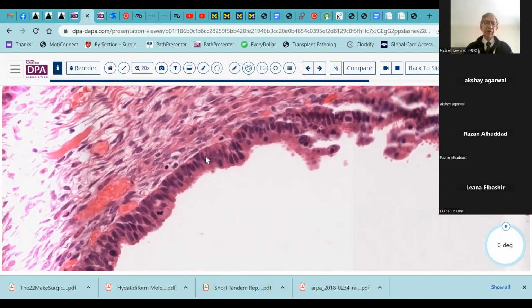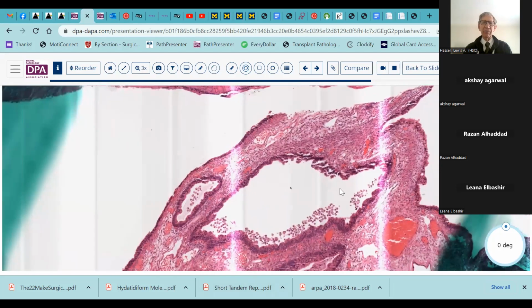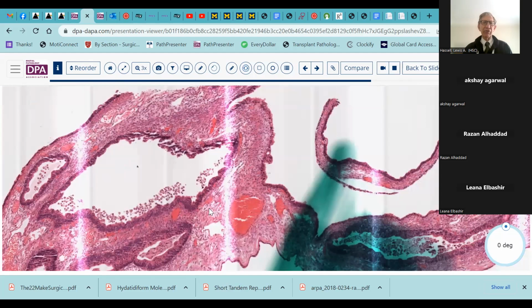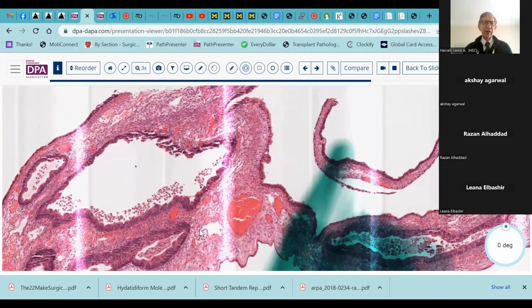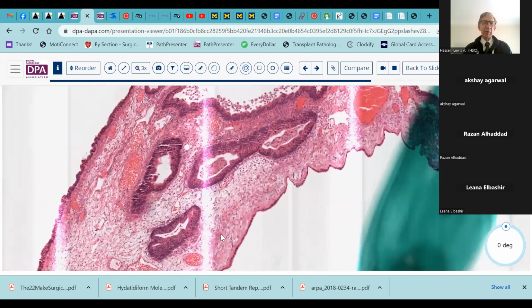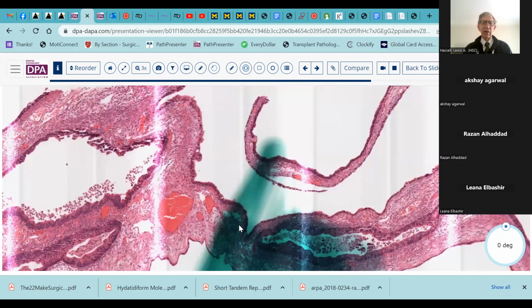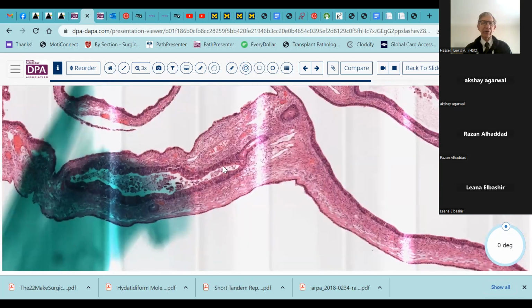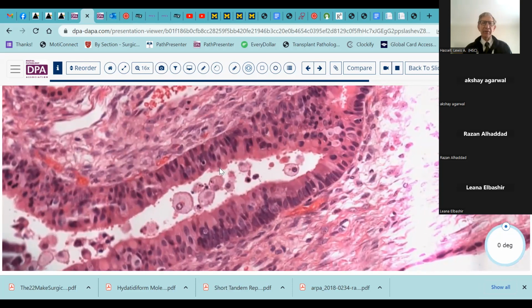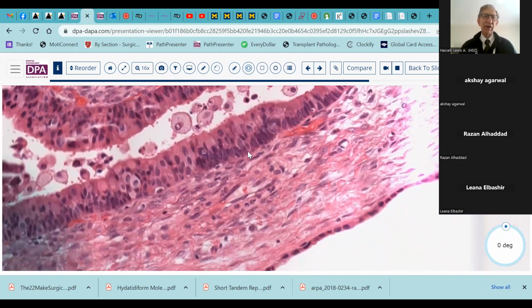And so then the other feature here is, do we want to consider this as being atypical? Well, here's a mitosis, maybe here's a mitosis as well. And so I think there is a degree of proliferative activity here. In terms of architecture, it certainly doesn't make it to the level of being atypical hyperplasia or something of that sort. And so I don't think I would qualify it in those terms as being a truly pre-neoplastic process. But I would be concerned about it because you do see a degree of proliferation here.